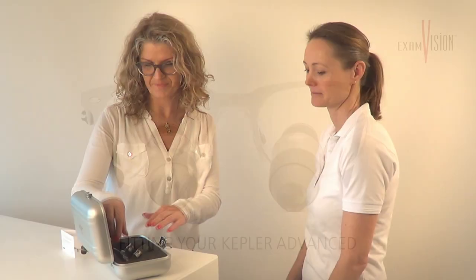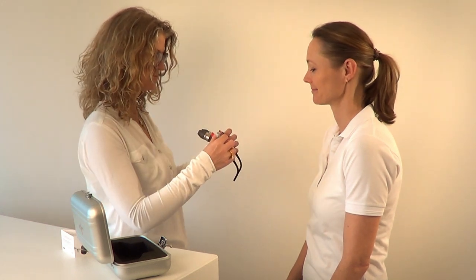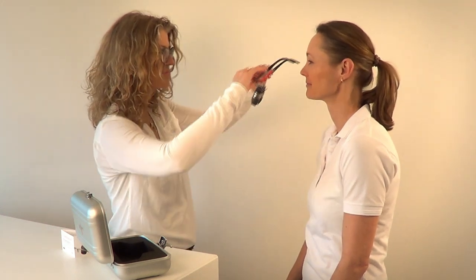Congratulations on your new Kepler Advanced Loop from ExamVision. This film will show you how to fine focus your loop.